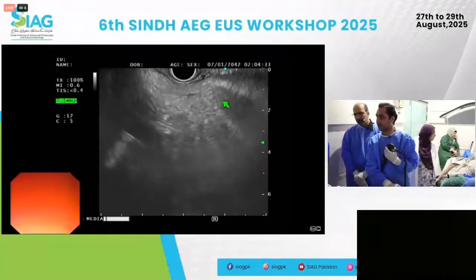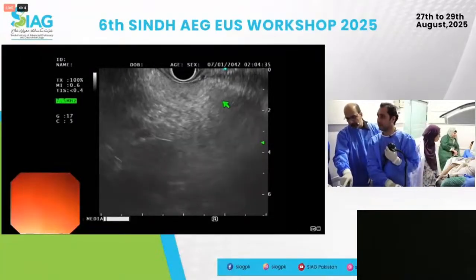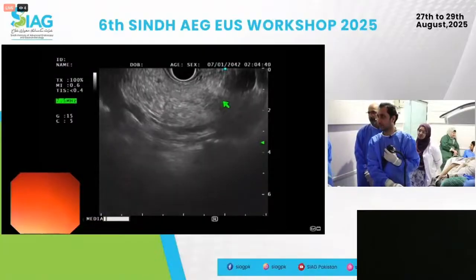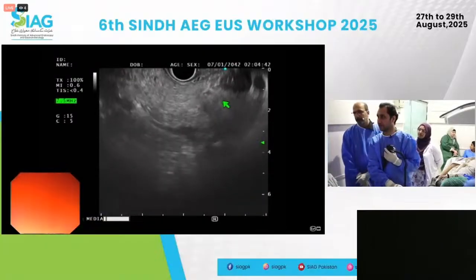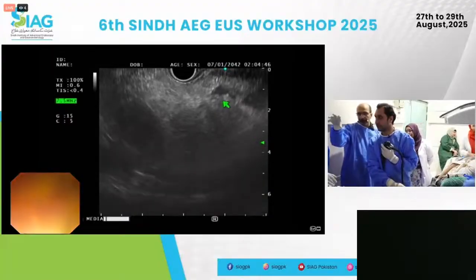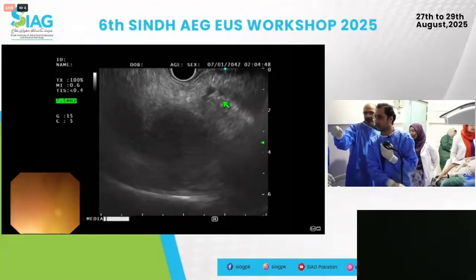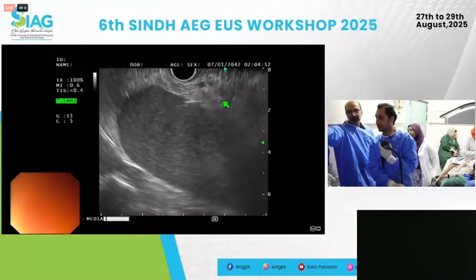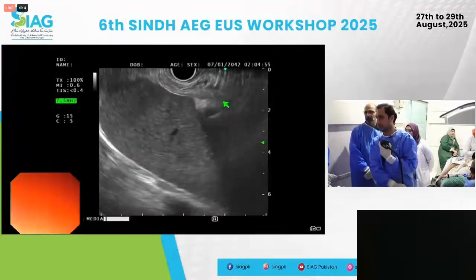It's a very bright pancreas section. Usually we see this there, but you reduce the gain a bit. So that's still the pancreas and PD. The problem is the peripancreatic fat and the pancreas merge together, so it can become hard to see, but that's where you're losing it, and there's your spleen. Okay, good. Pull back. Keep coming out.